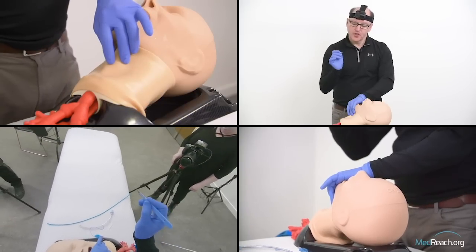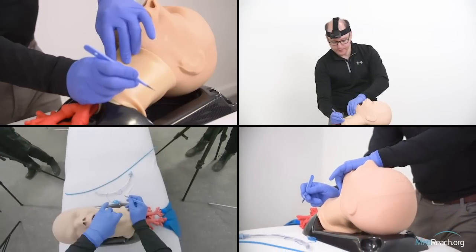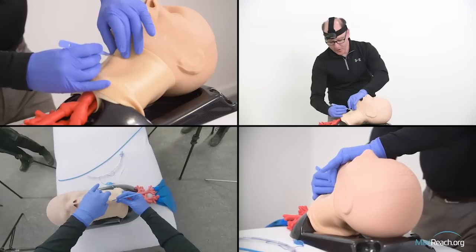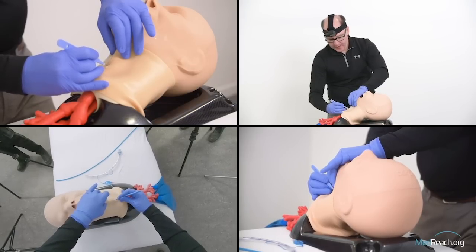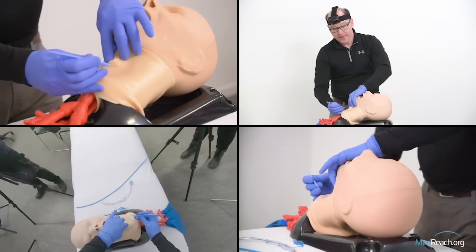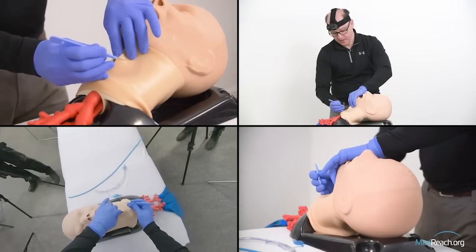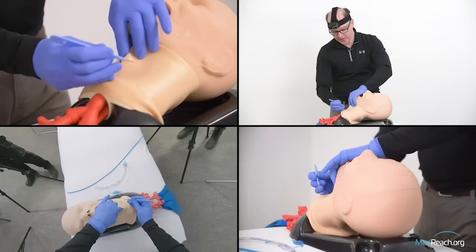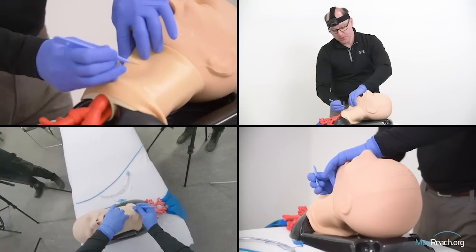I pick up the blade, choke up so I don't have a lot of distance, and rest my hand on the sternum. I make a vertical incision from about mid-thyroid down over the cricothyroid and just onto the beginnings of the trachea. At that point, this incision is not very aggressive — it's just through the skin — but it allows my index finger of my non-dominant hand to explore that space.